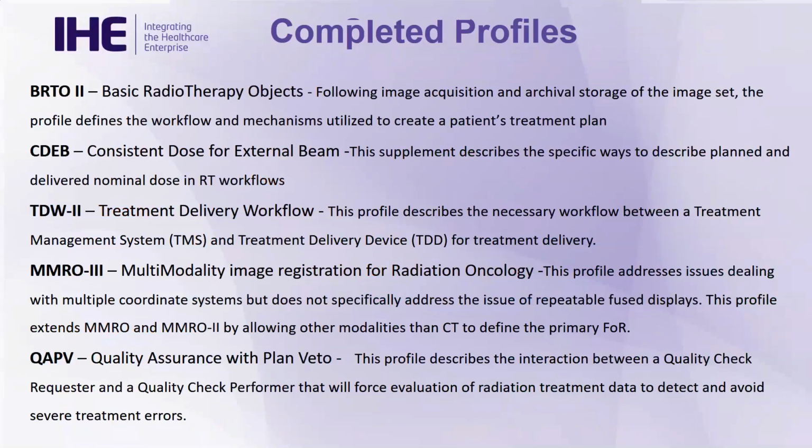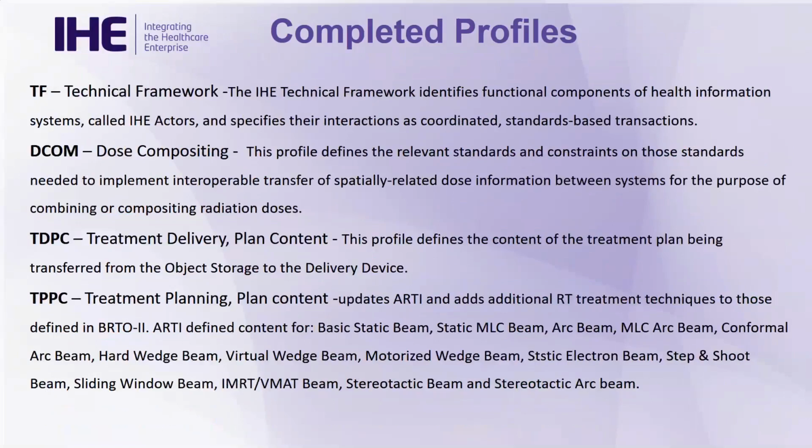But you can see we have workflow, we have content, and there's more. To be accurate, technical framework is not necessarily the same really as a profile. It's the structure off which everything hangs. All these things you can type in IHE-RO dose compositing or IHE-RO technical framework, and Google will take you to a website that has all these documents. And there's links later on that also will take you to the places where all these are.